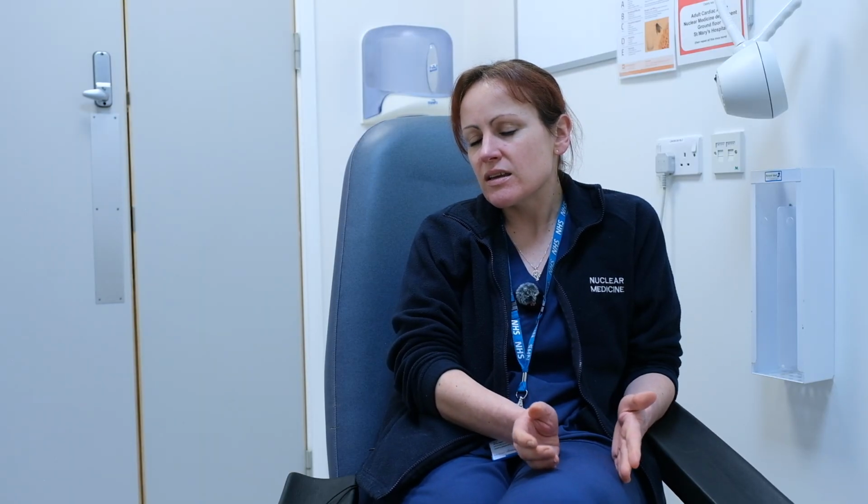The main reason we're asking the questions is because the bone scan is generally a sensitive test, but not a very specific test. So if they've had any recent falls or any recent fractures, it's good to have that clinical history to match. So when the doctors are looking at the pictures at the end, they can match the patient's history to the images.